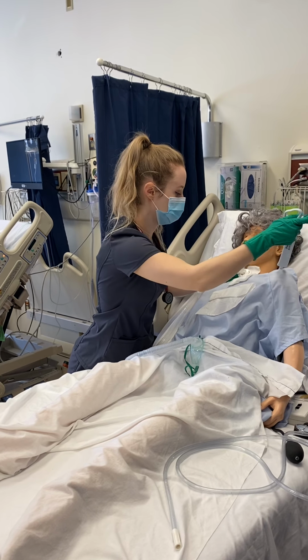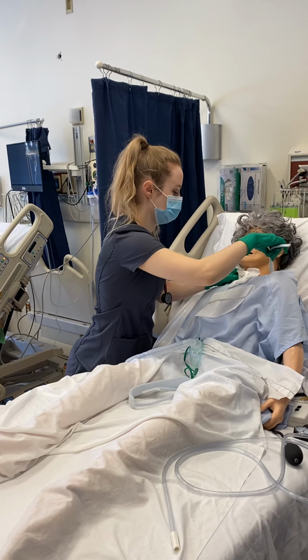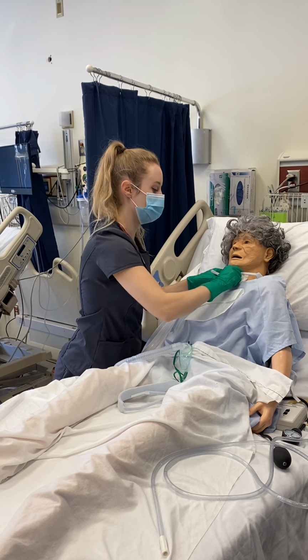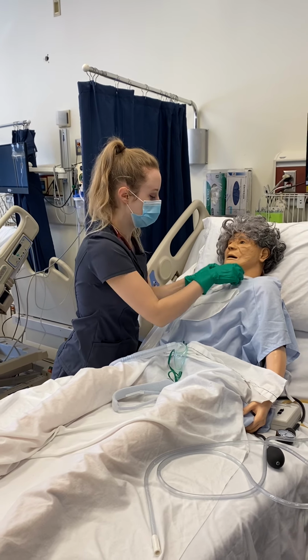Removing the old one. And I want to make sure this is snug, but it's not too tight. I should be able to fit about 2 fingers in between. And there you have it.